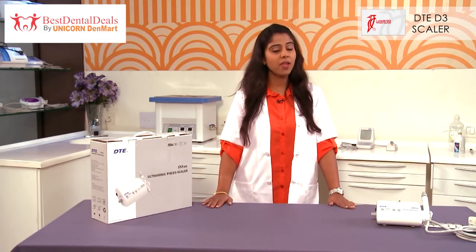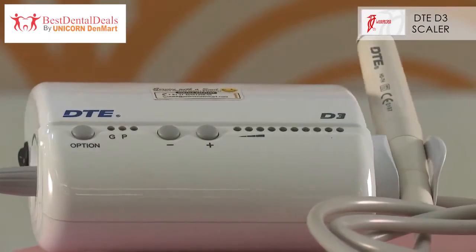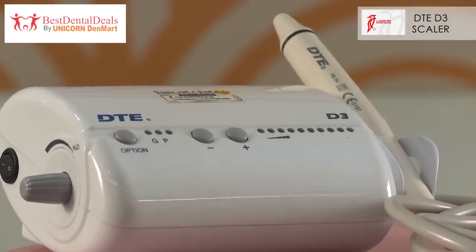Hi, I am Dr. Smriti and today we are going to talk about the product range from Unicorn. To start with, we are going to first talk about the Woodpecker DTE-D3 Ultrasonic Piezon Scaler.